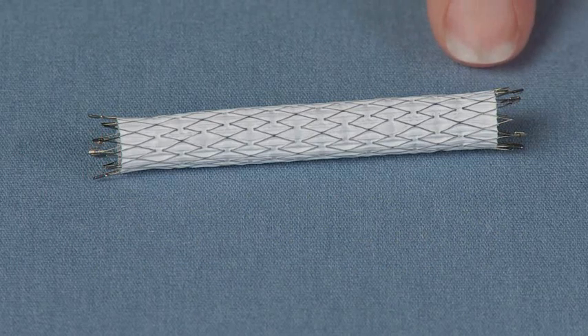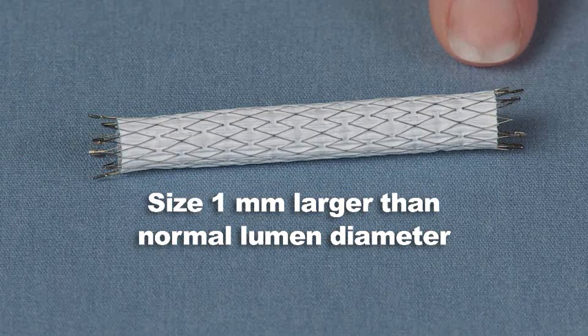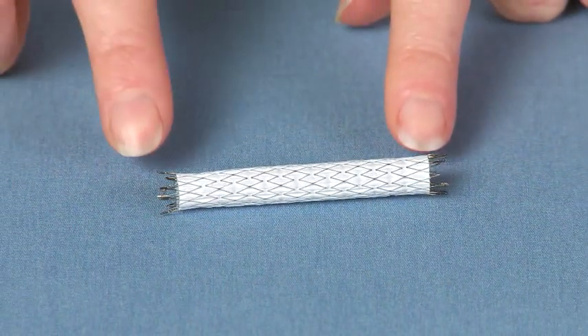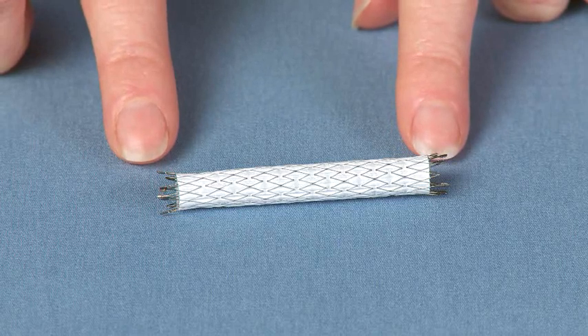The stent graft diameter should be sized approximately 1 millimeter larger than the normal lumen diameter. Oversizing of more than 2 millimeters relative to the lumen should be avoided. When selecting the stent graft length, keep in mind that 2 millimeters of the Fluency Plus stent graft are uncovered at each end.